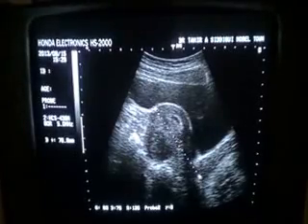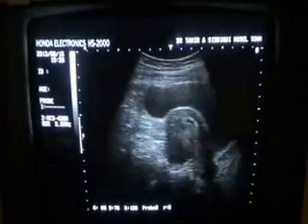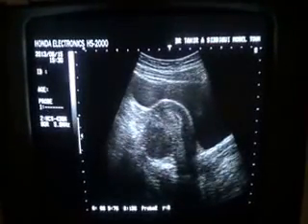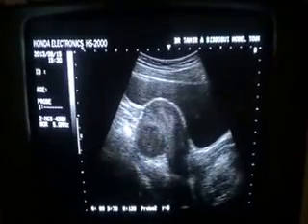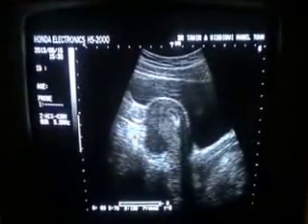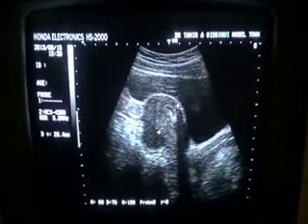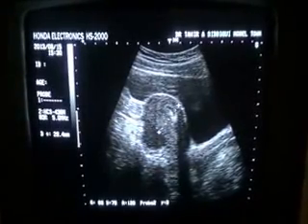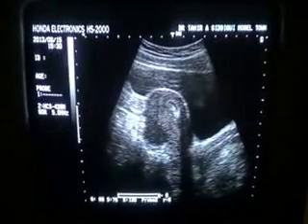Now we see that the uterus measures approximately... I will try to rely on the anterior-posterior diameter because the uterus is elevated. So this should be between 2.5 and 5 centimeters. So this dimension measures 2.9. So the uterus is normal in dimension.